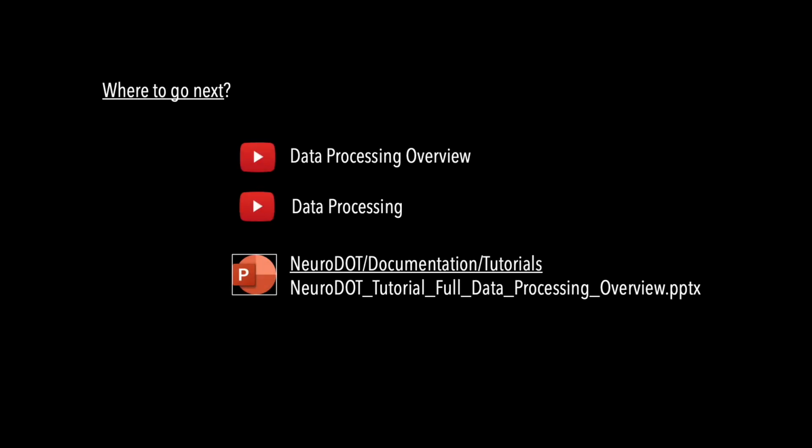The data quality assessment is an integral part of the data processing pipeline. As a next step, you may wish to review the 2 data processing tutorials, starting with an overview that summarizes how the different tutorials fit into the overall picture, followed by the full data processing tutorial that presents the processing pipeline in detail. Finally, when you want to begin hands-on training or simply want to explore details of how QA is coded in NeuroDOT, the PowerPoint tutorial listed here offers self-guided instruction using an accompanying MATLAB script which implements QA, pre-processing, image reconstruction, and visualization, working with sample array data included with the distribution.